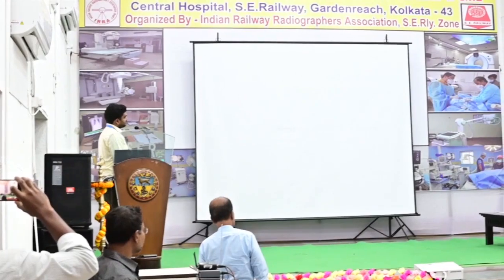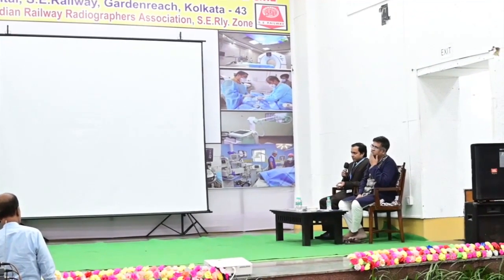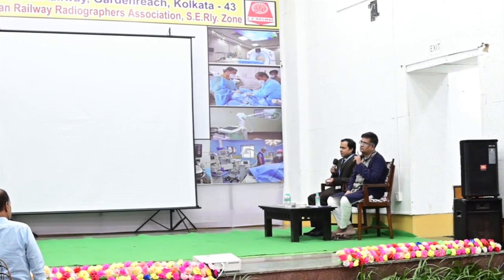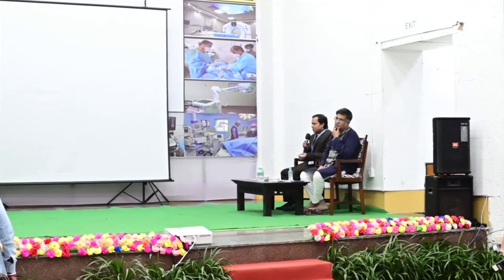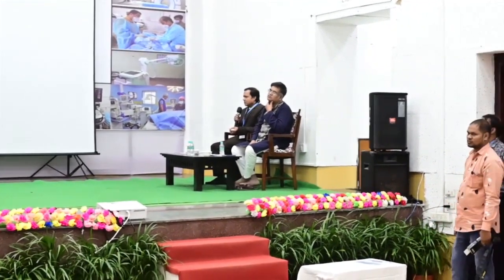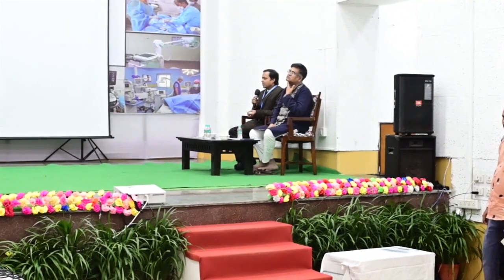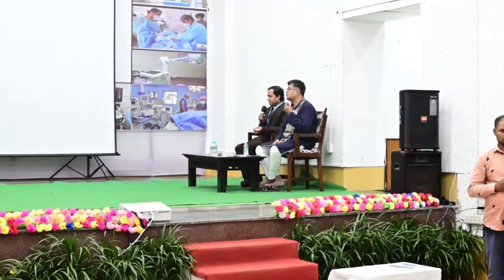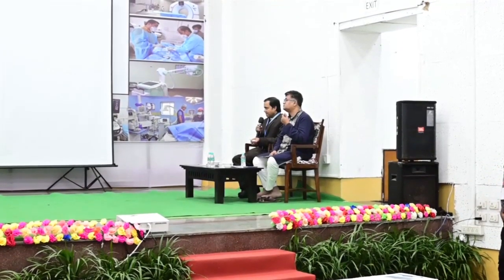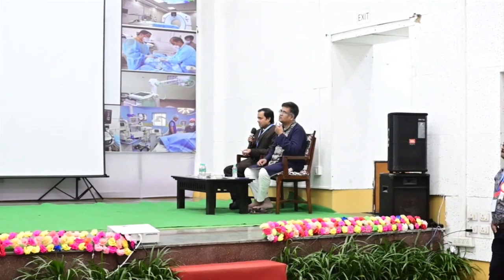Okay. What is an image intensifier? Image intensifier was used in older days, inside the fluoroscopy, sir. It has a photocathode and it increases the amount of photons. Why is it used in fluoroscopy? Because we can take an image with low radiation and it will increase the number of photons. We can take an image with low radiation, sir. How much is it increased? In which grade?